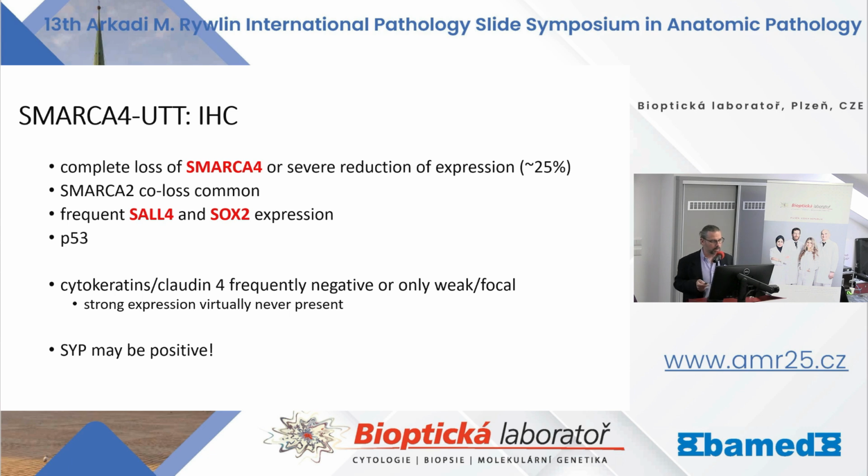SMARCA4 together with SMARCA2 antibodies are probably the most useful. There is frequent SALL4 and SOX2 co-expression in these tumors. Almost every case is p53 abnormal, and importantly, cytokeratins and claudin-4 epithelial markers are very frequently completely negative or only show very focal and weak staining.